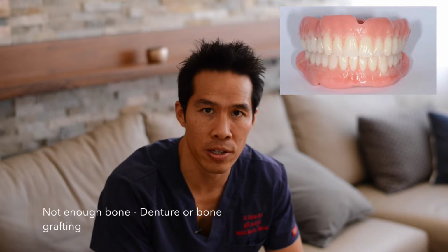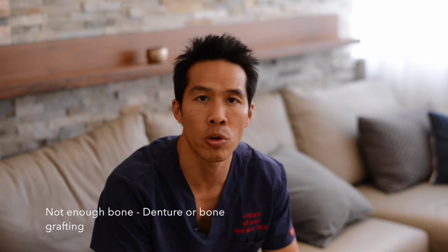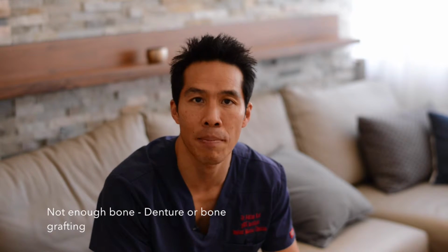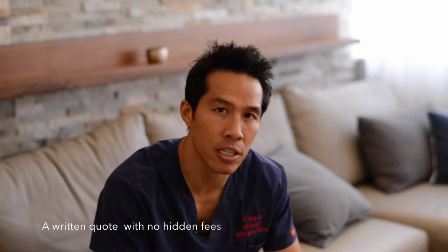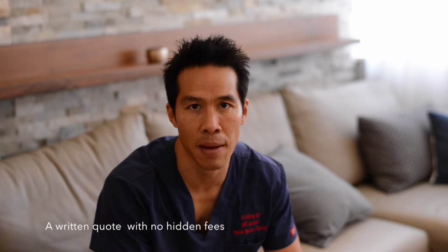If there isn't enough bone, then there's two options for the patients. Either it's a situation where we go back to traditional dentures, or it could be a situation where we may look at bone grafting in order to supplement the bone in order to be able to do all-on-4 treatment in the future. If there is enough bone, then we can definitely plan the entire case on the computer and we can write down an exact quote for that patient.